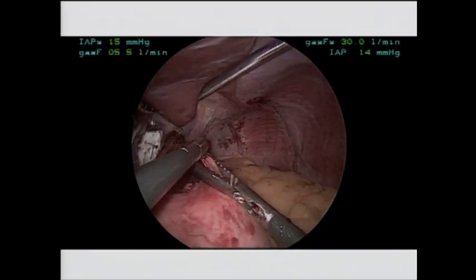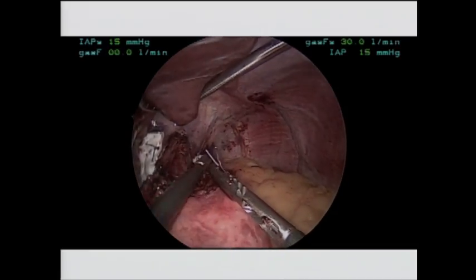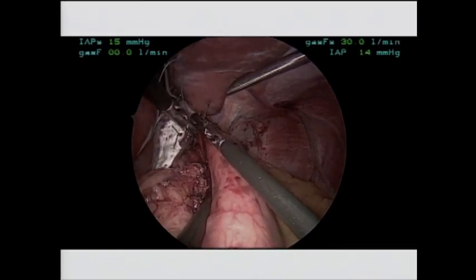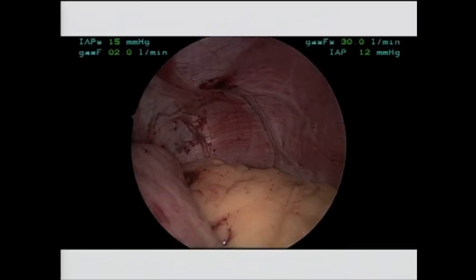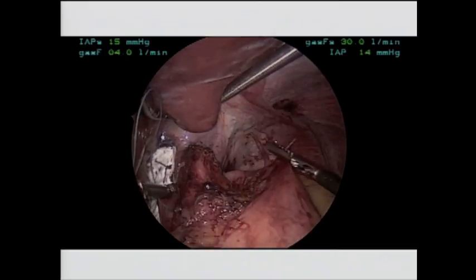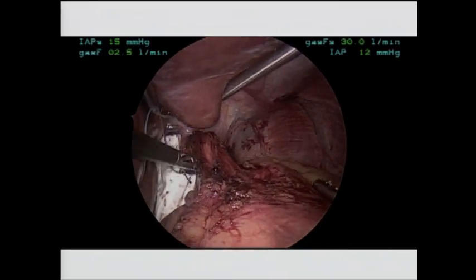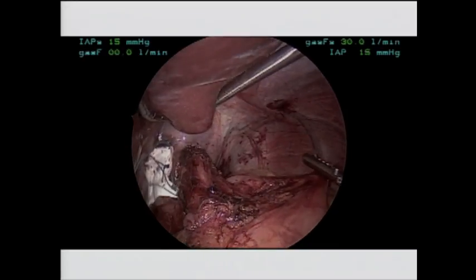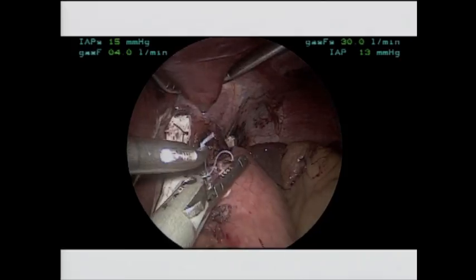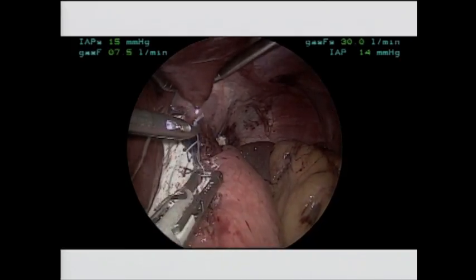And we're going to reach over and help the grasper from the assistant. And the jaws of those things are 2.5 centimeters long. You bring those two points together anteriorly at 10 o'clock, and that should create a symmetrical fundoplication. A little shoe shine. The short gastrics ought to be halfway between those two traction points as you look across the top of the fundus there. So those are equidistant.